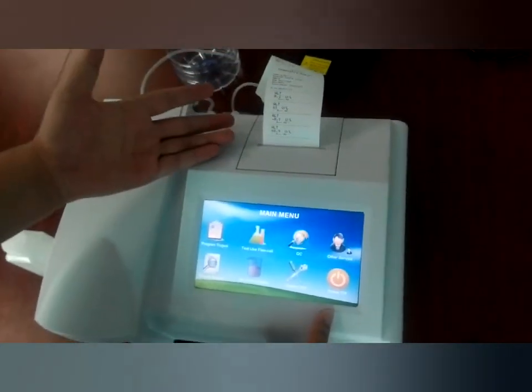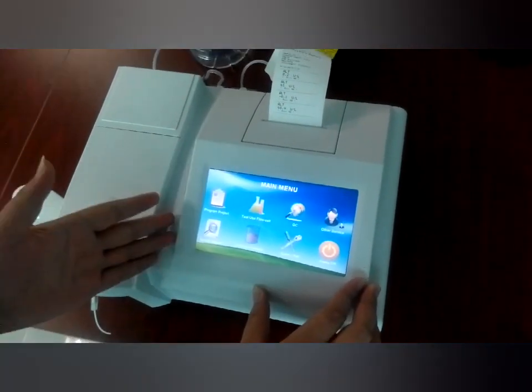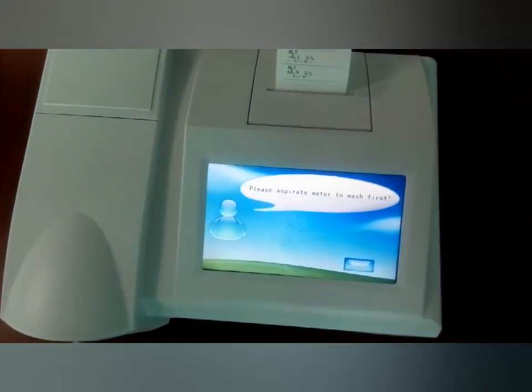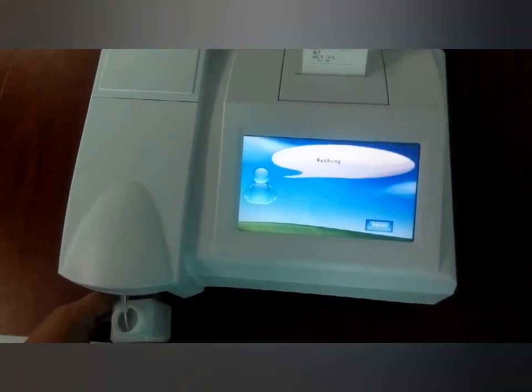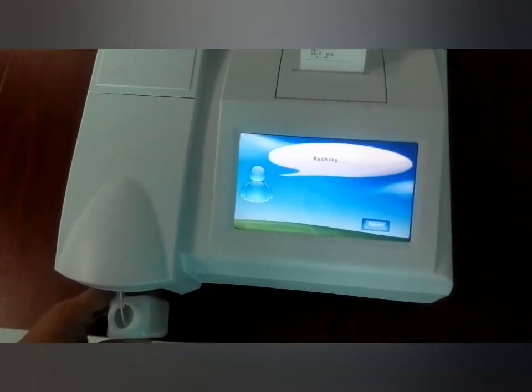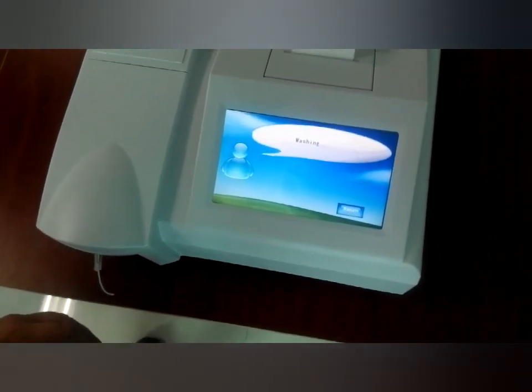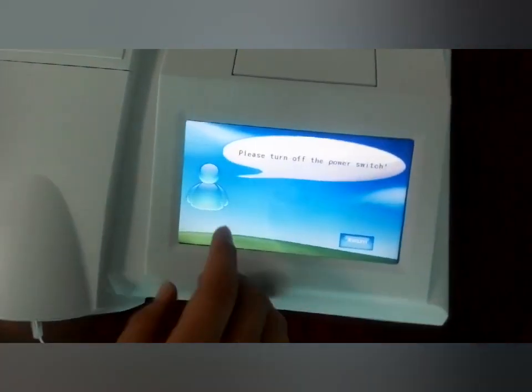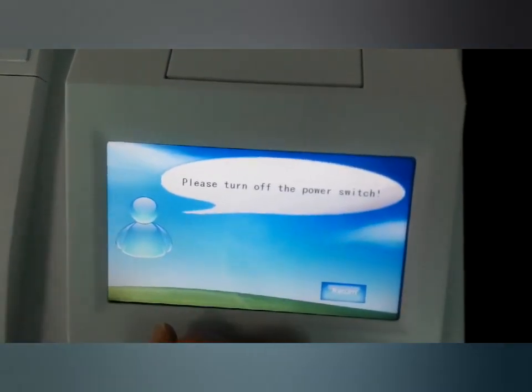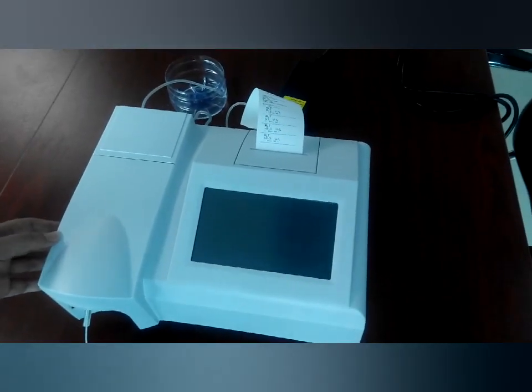After we finish the test for the day, we should power off the machine. Just click here for power off and it shows a prompt to wash first, so we do that. Now it shows 'please turn off the power switch.' We just turn off the power switch. That's all — hope you will use our machine very well and hope we will have a long cooperation with each other. Thank you.